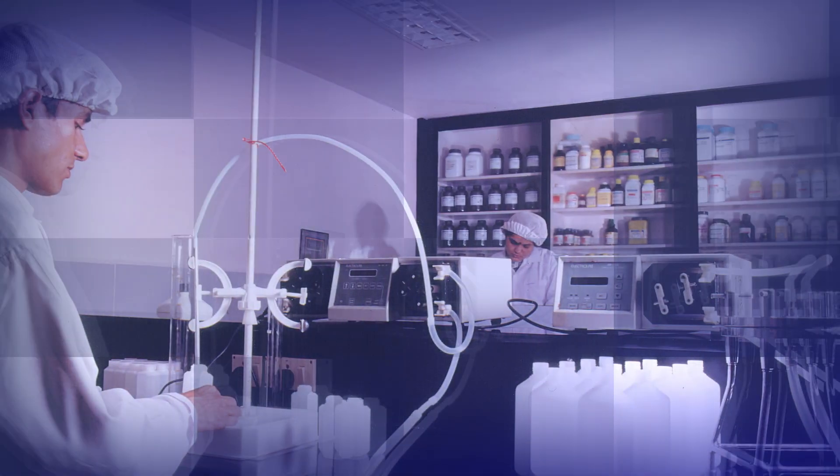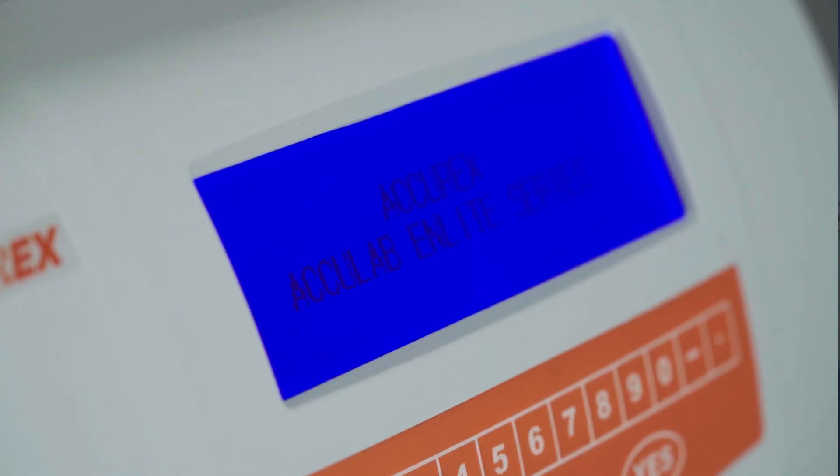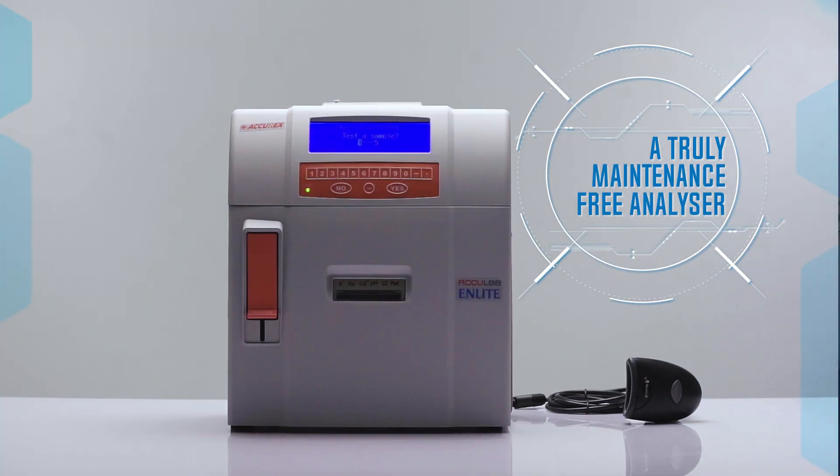Acurex, serving the diagnostic industry since 1984, now brings to you a truly maintenance-free electrolyte analyzer.